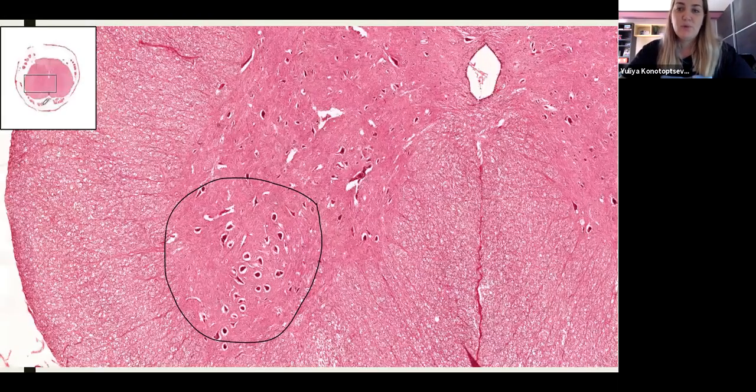Okay, so you can see where we are, where the ventral horn is going to be, right? And you can notice that in this ventral horn, we can see a bunch of huge cell bodies. These cell bodies belong to the alpha motor neurons. What is another name for these alpha motor neurons? They are lower motor neurons. Lower motor neurons innervate what exactly?